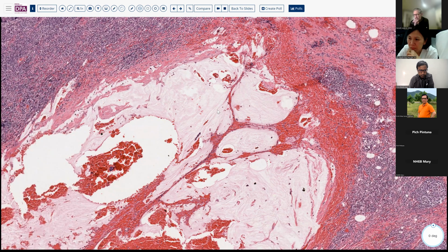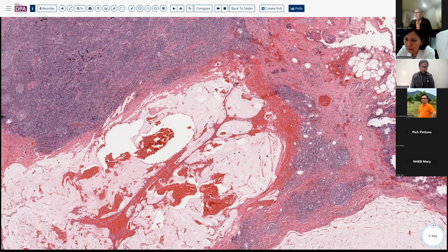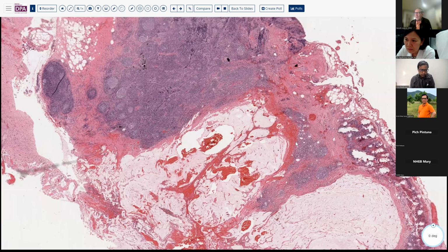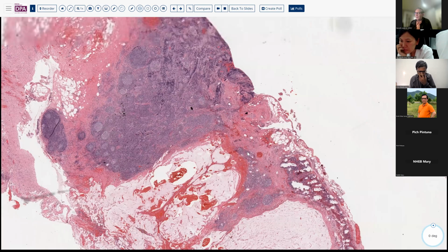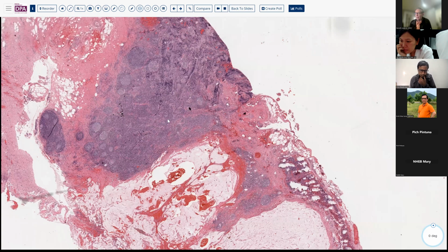So it's a very mucin-rich carcinoma that's developed in this case, and it's directly invading a lymph node. That still qualifies as a lymph node spread, so you'd stage it as an N1 lesion, even though it's probably just direct extension into the lymph node. But in terms of staging, the direct extension, metastatic, subcapsular extension, those are all treated the same way in our staging criteria.